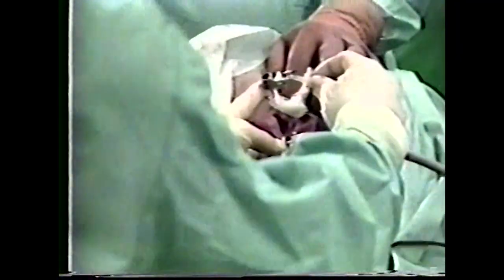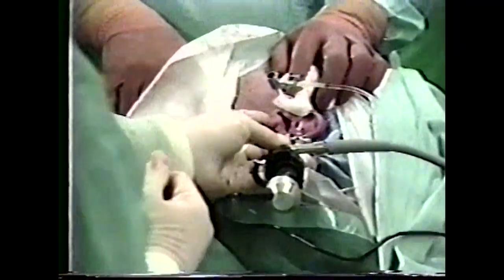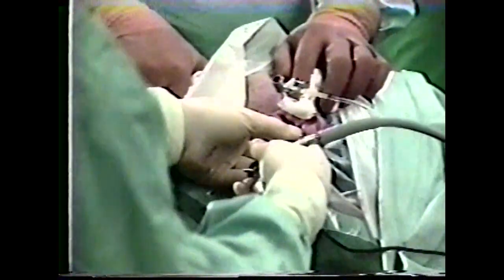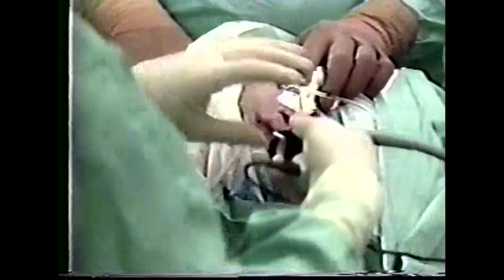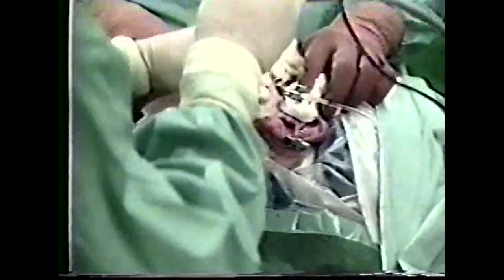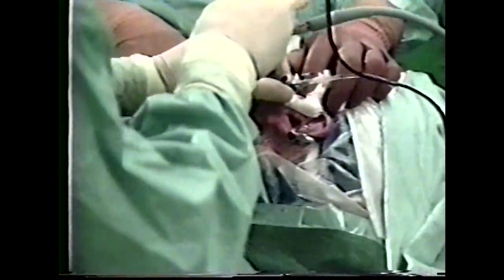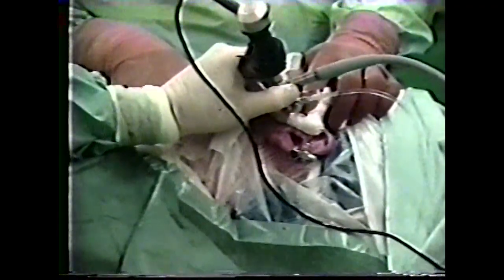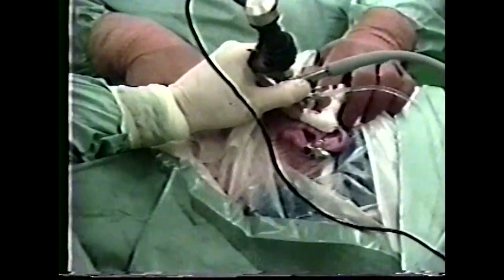Inflow is moved from the endaural scope cannula to the infralateral cannula. The 30-degree scope can now be moved to the infralateral portal, and the endaural scope cannula can be capped with a rubber stopper and used as an instrument portal.